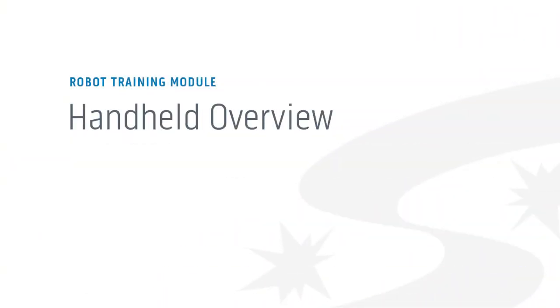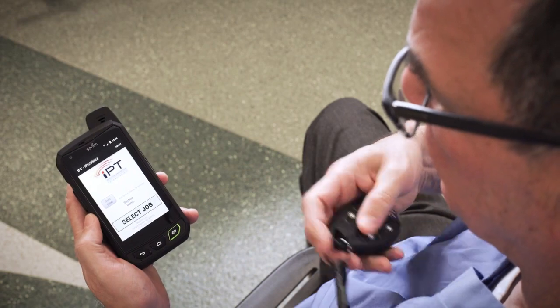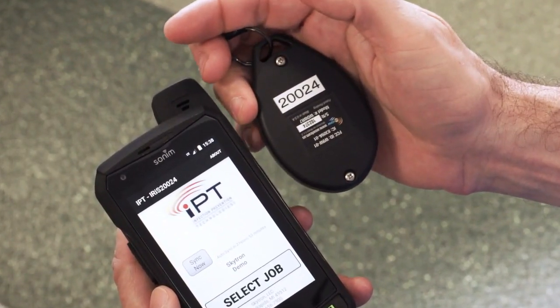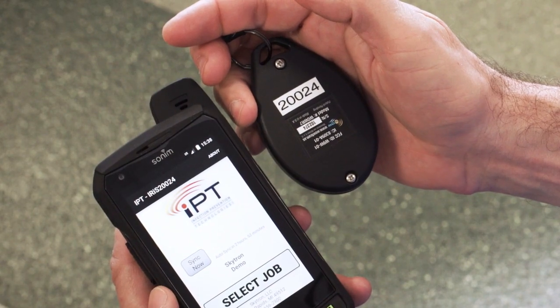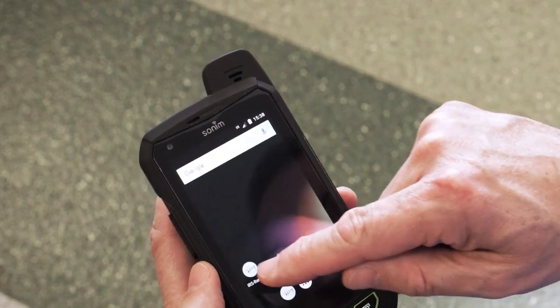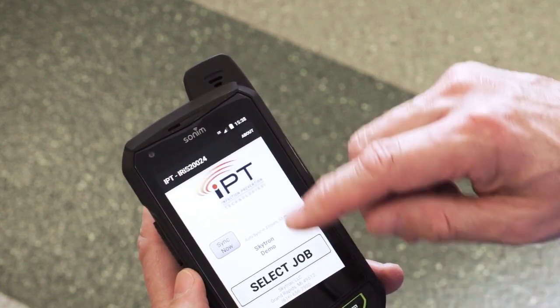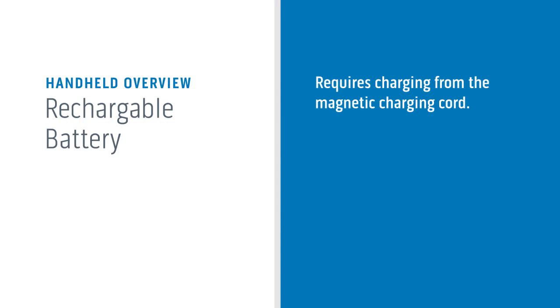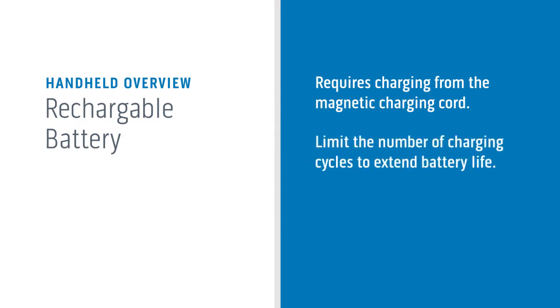Now we'll guide you through the handheld, which acts as the ignition of the system and also shows you real-time status during treatment. Devices, handhelds, and door sensors work only with their intended machine and must have matching serial numbers. Because pens and pencils will damage the screen, the handheld's touch screen may only be used with your finger. A rechargeable battery requires charging from the magnetic charging cord, and it's best to limit the number of charging cycles to extend battery life.